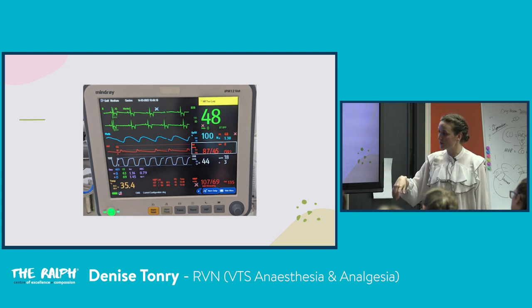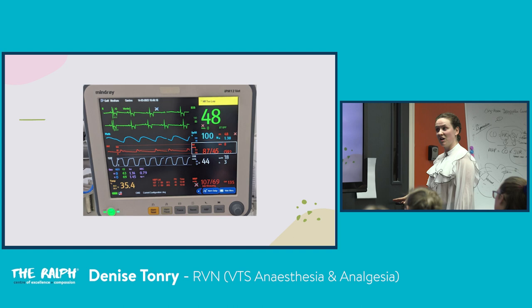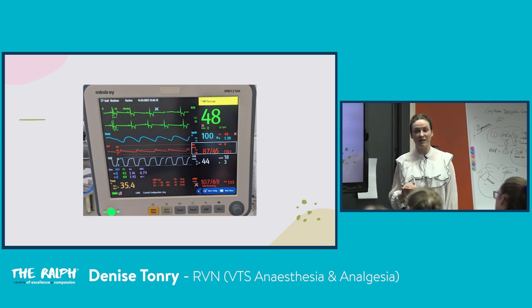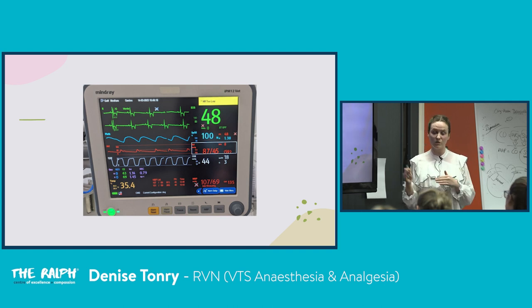And you can see my ISO level is around 1.14. I tend actually not to run super low on ISO unless I have a lot of MAC-sparing CRIs. I'm not that brazen with ISO. I prefer them to stay asleep. Unless someone's going to be giving me CRIs to remove my ISO or to drop it, and a lot of us in referral practice lose the ability to check depth just because of the positioning of the patients. And I tend not to run them too low on ISO.